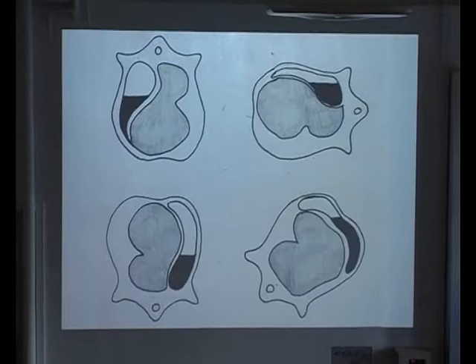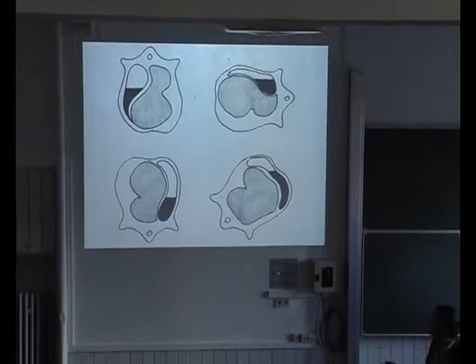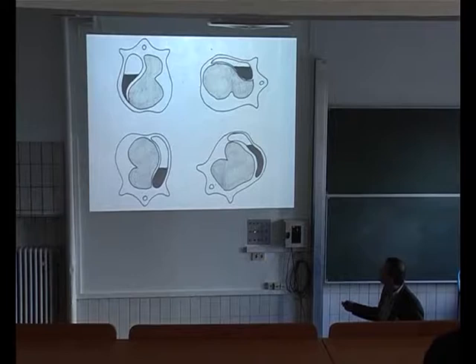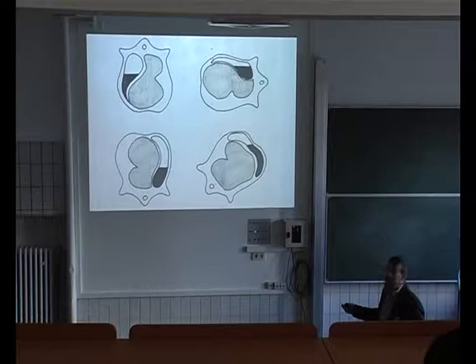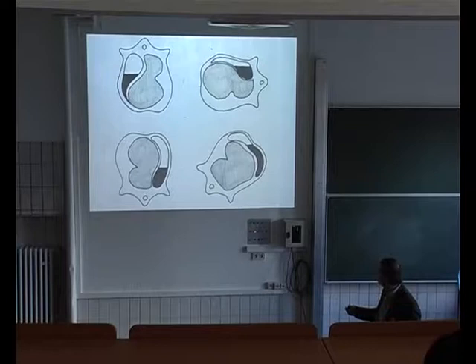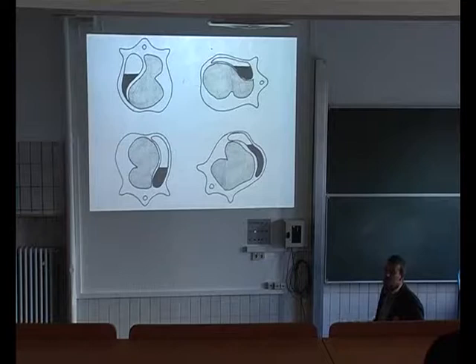But now we have a second cow, and if we listen with our phonendoscope, we have a similar situation. We have a good filled rumen, and we have a clear ping of the abomasum, but we have the abomasum half filled with fluid. And now we bring the cow on the right side down in dorsal recumbency, half right. And what will we see? The abomasum turned not back to the right side, is still on the left side. And if we fix the abomasum in this condition, it's a wrong fixation with problems after the surgery.